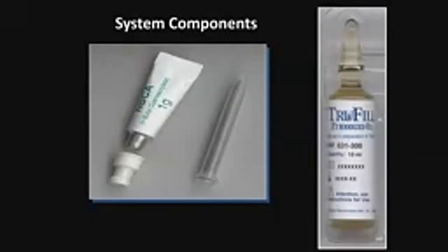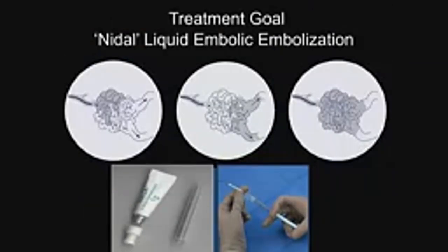So utilize that. Now, my choice of embolic agent for spinal cord AVMs and shunts, whether it's a pediatric population, where we see a fair amount of metameric disease, is glue. The reason is penetration. Glue penetrates generally up to 50 microns, and this is how we use it. Onyx has a penetration into the micron areas, 10 to 5 microns. So you get significantly more damage to the cord if you accidentally end up having spillage and you don't see that. Simple as that. You won't see Onyx angiographically during injection. It's impossible, just because of the depth of penetration.